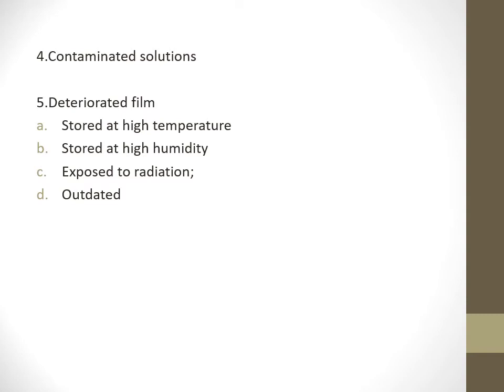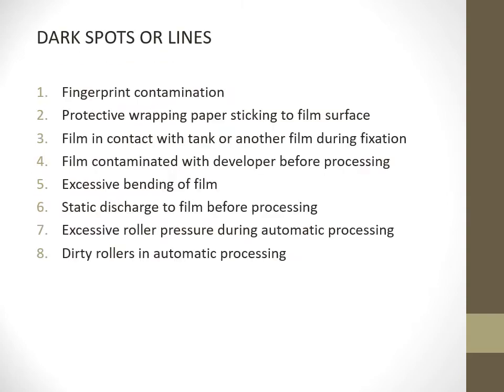Exposed to radiation films. See, whenever you are taking an intraoral periapical radiograph, don't put them in your pocket. Take only the radiograph to be exposed, shoot it, process it and then come out. Don't take 2 to 3 radiographs with you. Otherwise, they get exposed to radiation, which again causes film fog. Outdated films which have passed the expiry date also cause film fog.